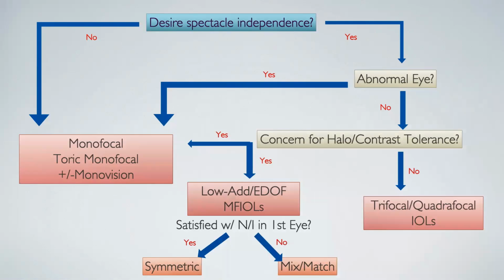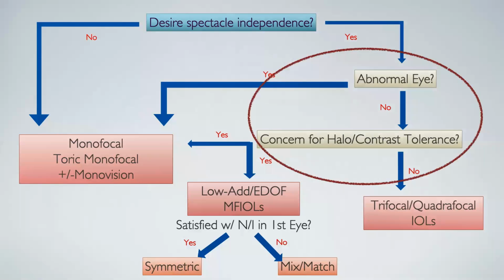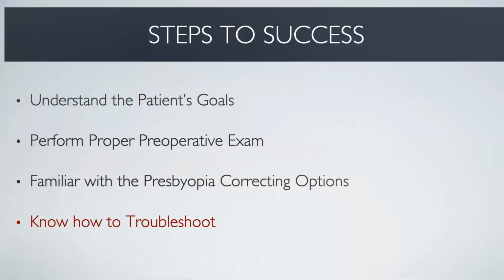And if they have that pristine eye, perfect cornea, perfect retina, the quadrifocal option can be an excellent one and really cuts down the chair time because you're not really having to give up distance, intermediate, or near. You're able to get all three with the quadrifocal lens option. And really, it's this middle ground here, this gray zone, where cases and examples really become best. And we'll go over a few of these options here and what we did for each of those patients.